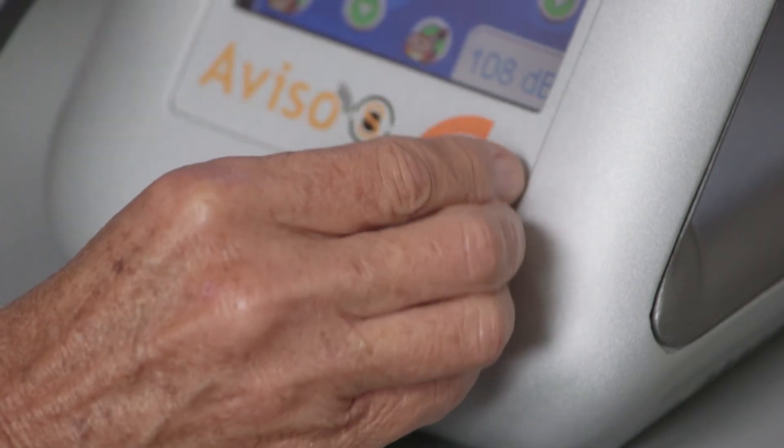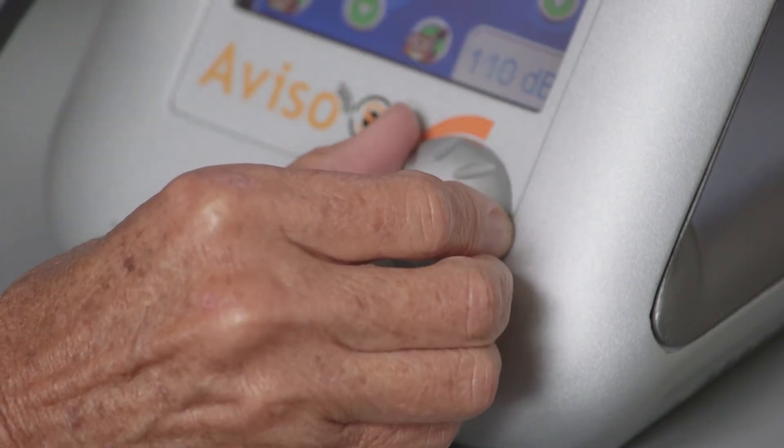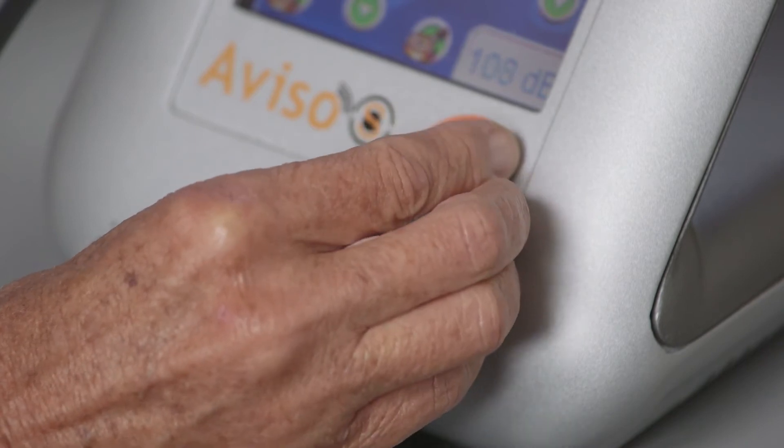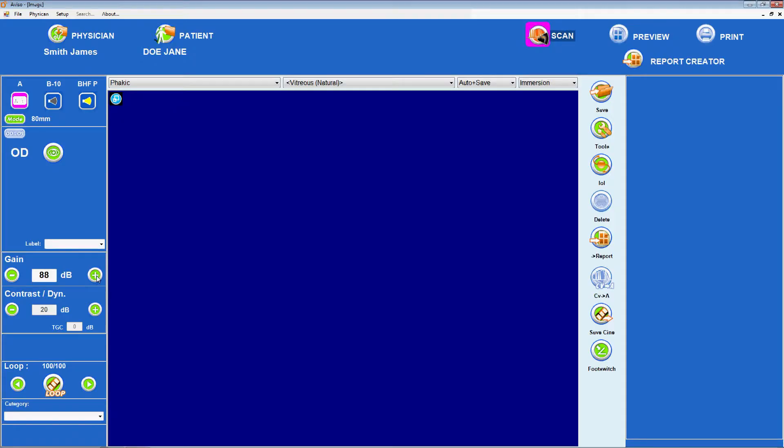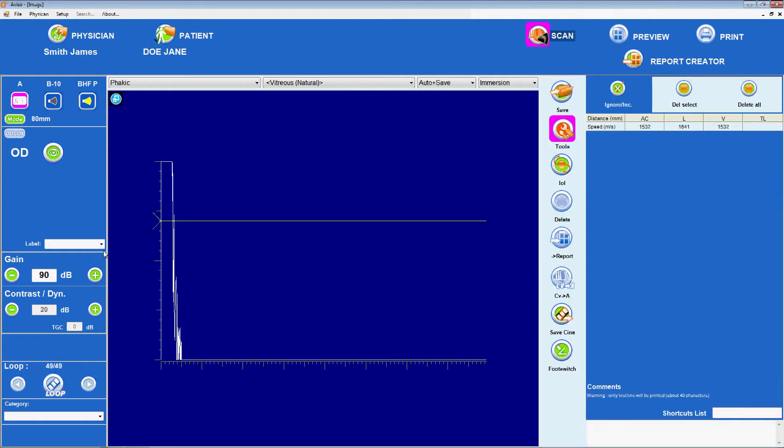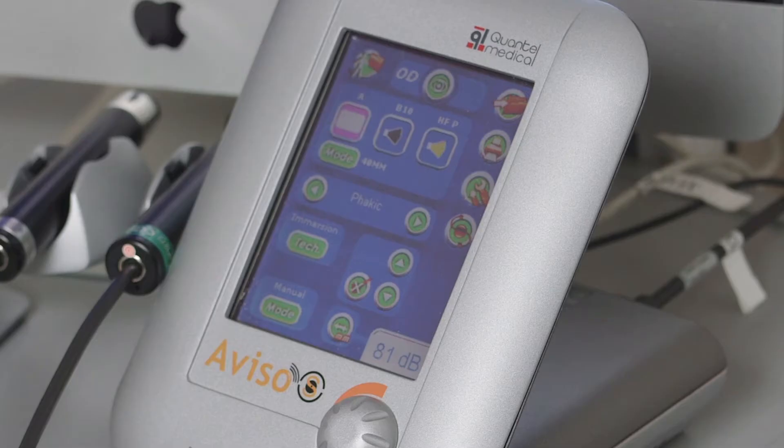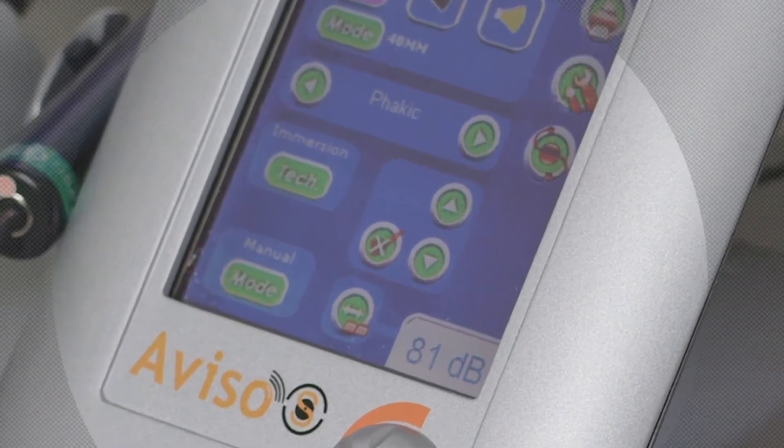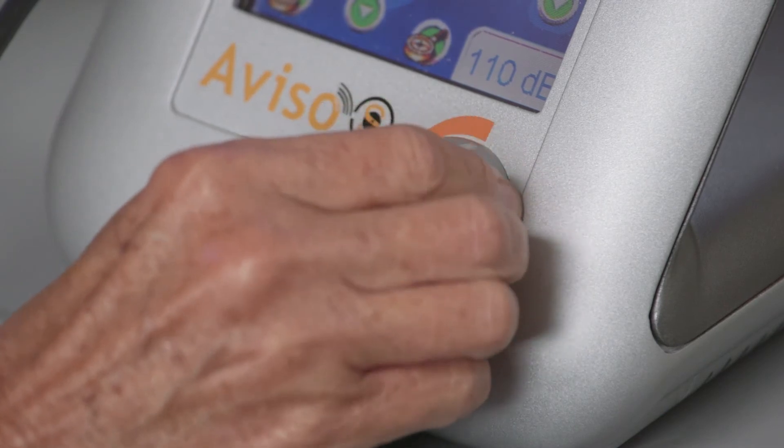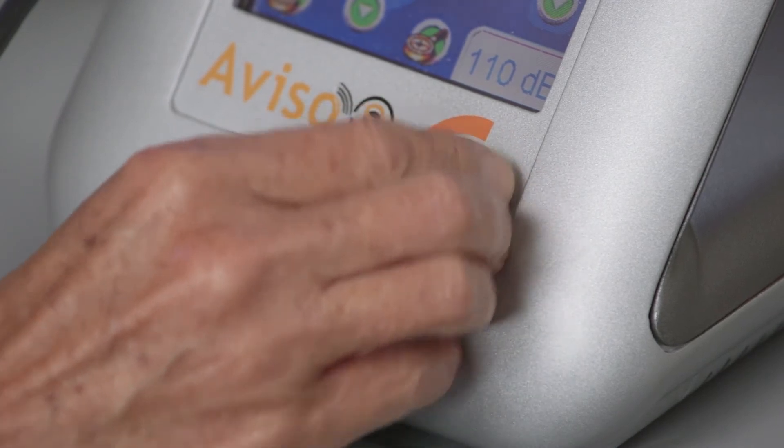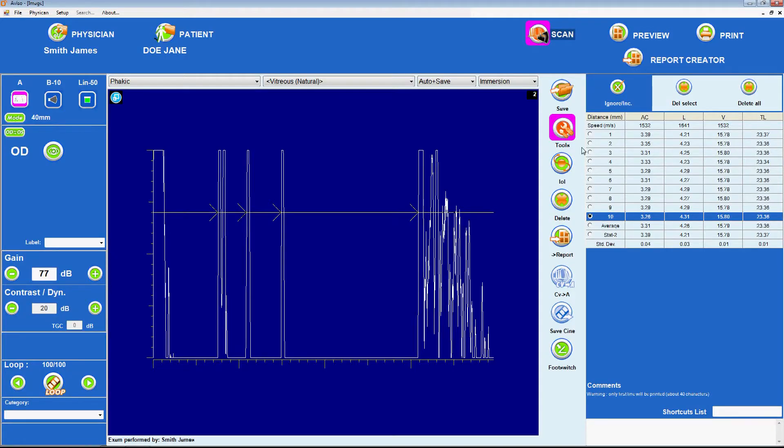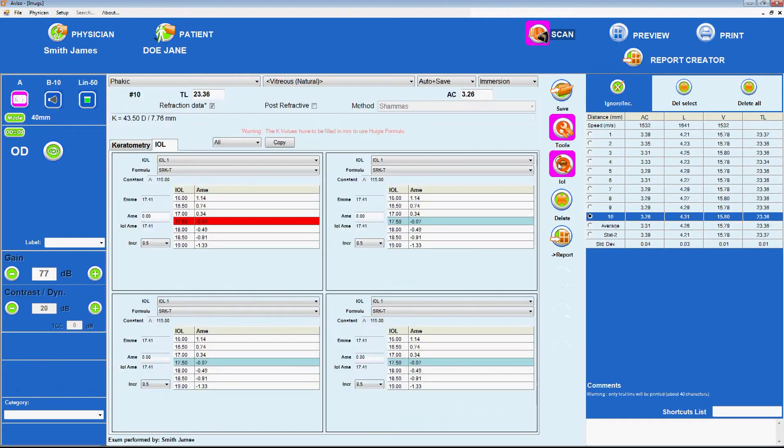We can adjust the gain by turning the grey knob at the front of the Aviso-S device or by using the plus and minus signs on either side of the gain readout in decibels on the left-hand side of the computer screen. Using the mouse or touching the double arrow MM icon at the bottom center of the touch screen interface, which changes to orange from green when selected, allows the user to adjust the position of the markers on the ultrasound readout using the grey knob. Then, activating the IOL icon on the right-hand side of the screen allows the Amitropia value to be selected.